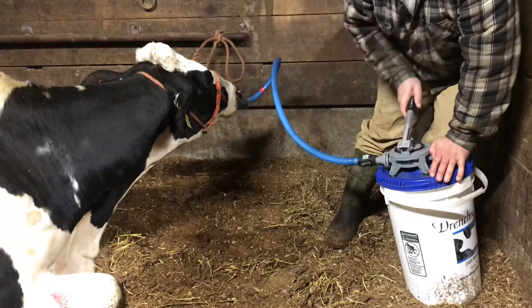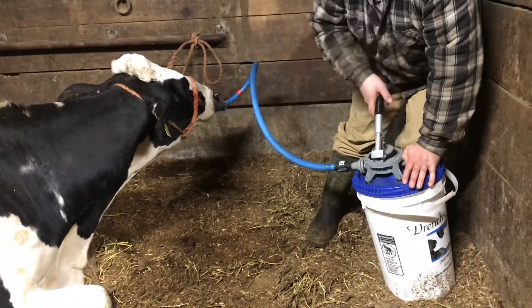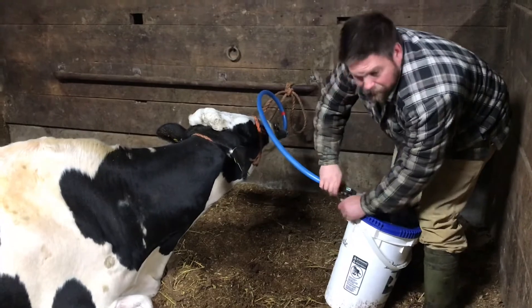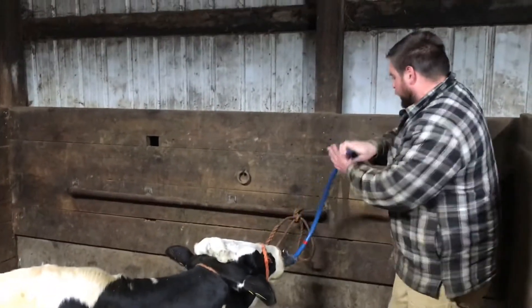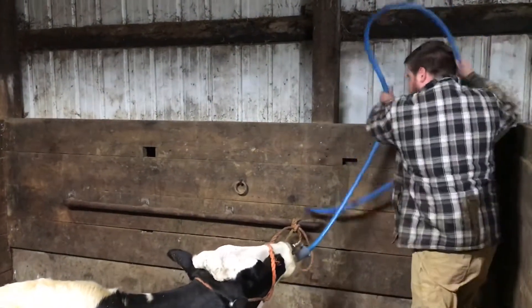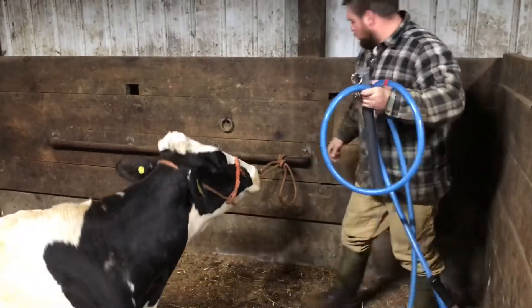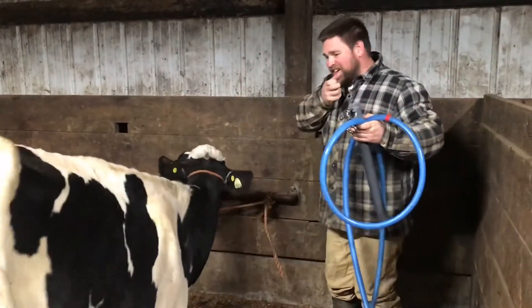That's good. It takes a little bit to put it all in. We're about done — we're all done. Disconnect. I always like to blow the last little bit. Unlock it, pull the line out, take out the nose piece. And she should get up if she wants to.